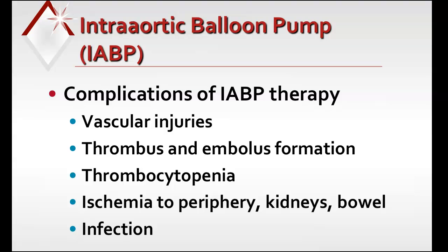All right, so I'm not necessarily overly concerned with whether you guys understand the mechanics behind the pump, but I do want you to understand more of the nursing stuff, and that includes the complications of therapy. So vascular injuries like dislodgement of a plaque, you can get aortic dissection, and compromised distal circulation. Those are going to be your common problems with balloon pumps.